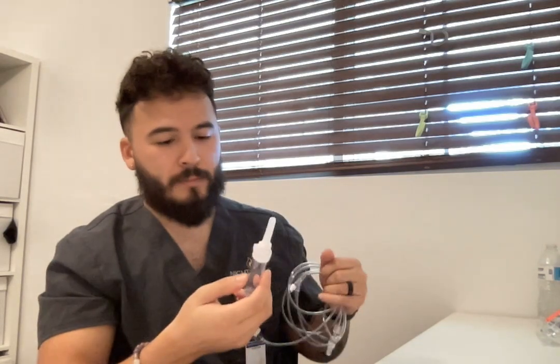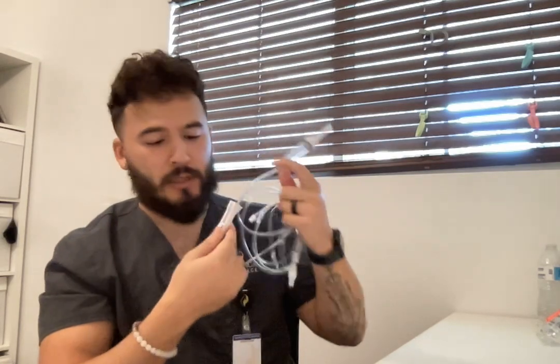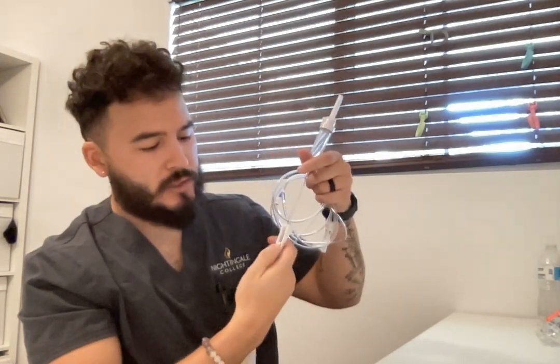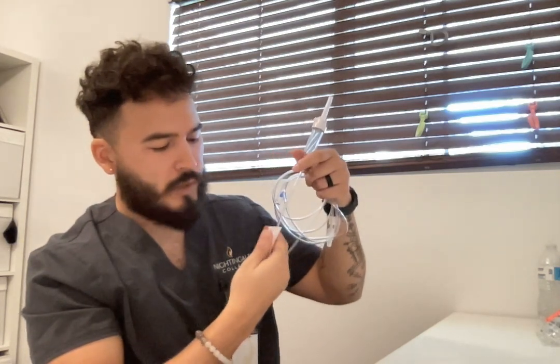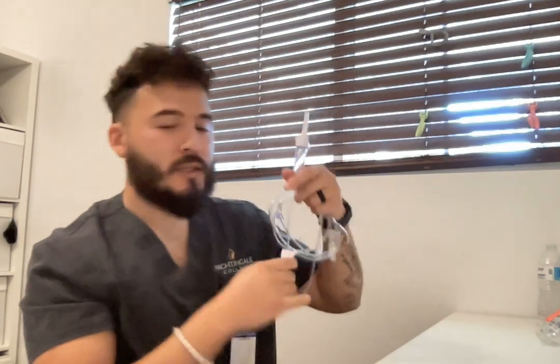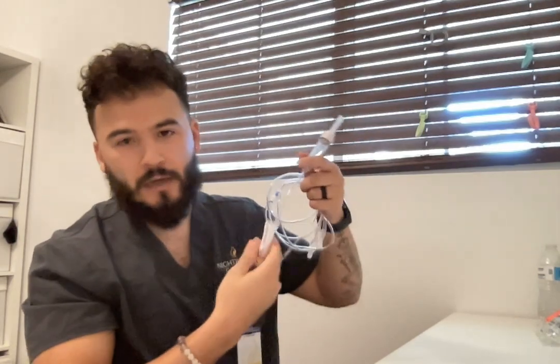We're going to squeeze it. Once we puncture the bag, we're going to squeeze it until halfway. And this is where it's going to drop into. And then we have our roller clamp. This is our regulator. I have it all the way clamped right now, but essentially we roll it up to allow full flow. And if we want to regulate it, we start rolling it down. Depending on how much medication or how much flow we want, we will roll it up or roll it down.